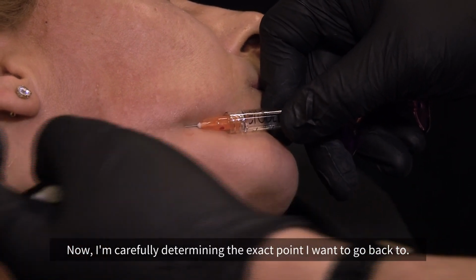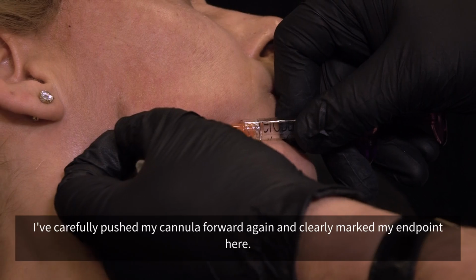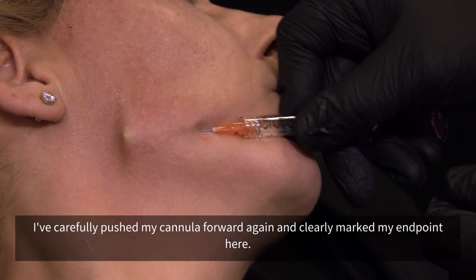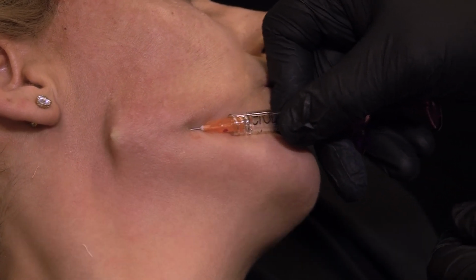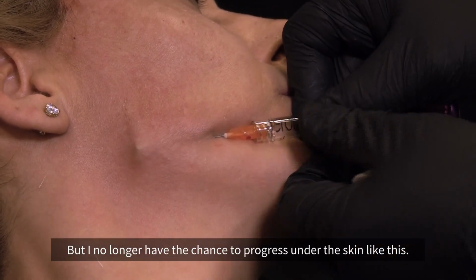Now I'm carefully determining the exact point I want to go back to. This should be my end point. I've carefully pushed my cannula forward again and clearly marked my end point here. If I continue, I will penetrate. But I no longer have the chance to progress under the skin like this.